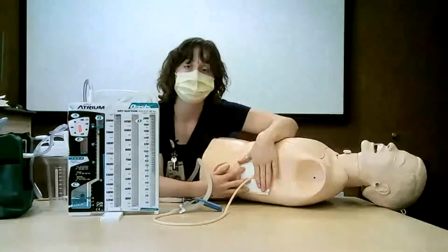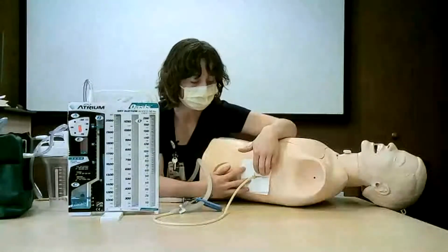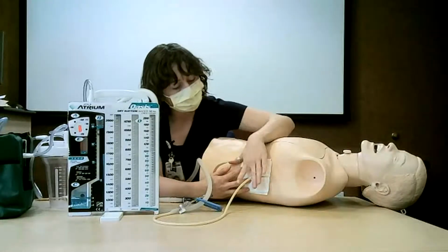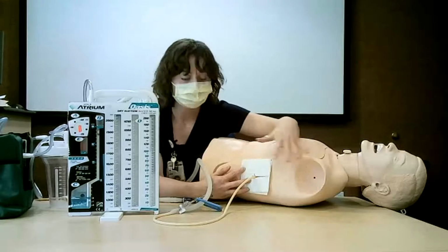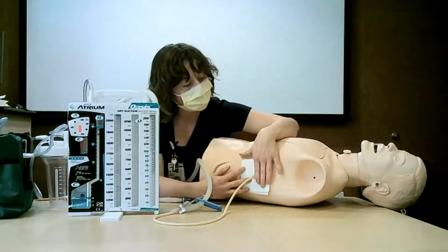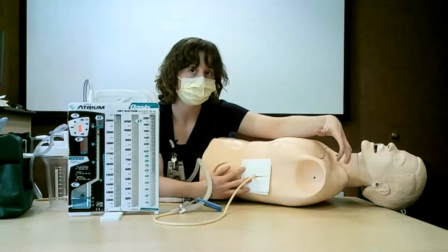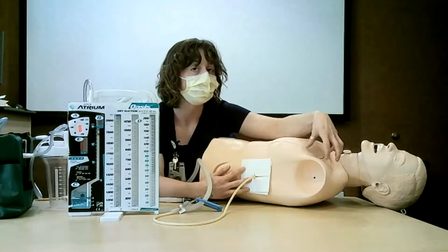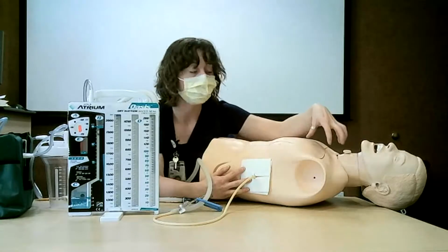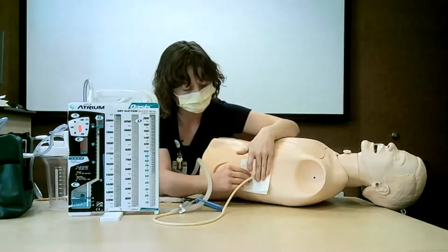You also want to make sure that you're assessing for crepitus at this time. Crepitus is air that leaks out into the subcutaneous tissue, and it feels like Rice Krispies popping around the patient's skin. The air will move upwards. It's not necessarily anything to be alarmed about, but it should be noted. And if the crepitus moves all the way up to the neck, it may impair the patient's ability to breathe, and it may also lead to vocal changes. If you're noticing a great increase in crepitus, or it is affecting the patient, please make sure that the surgeon is aware of that as well.